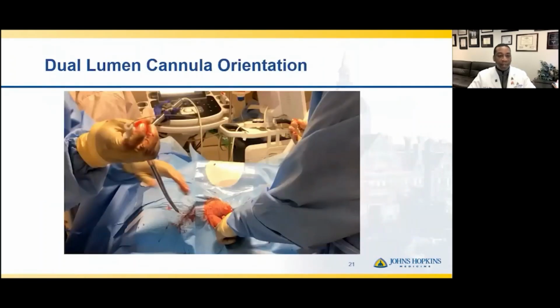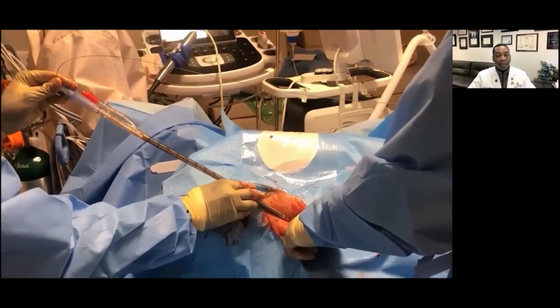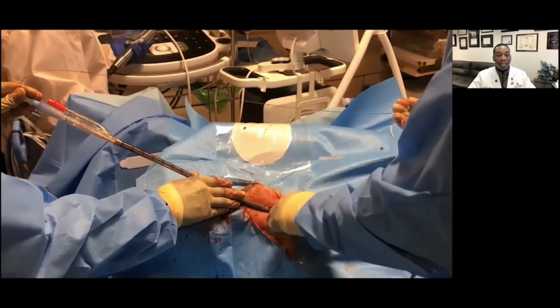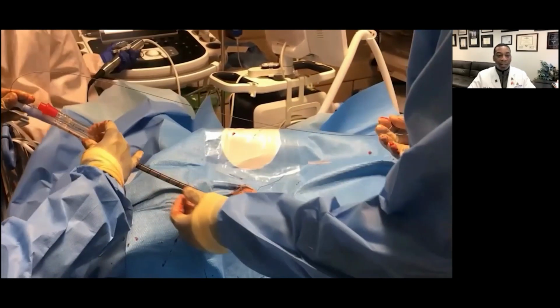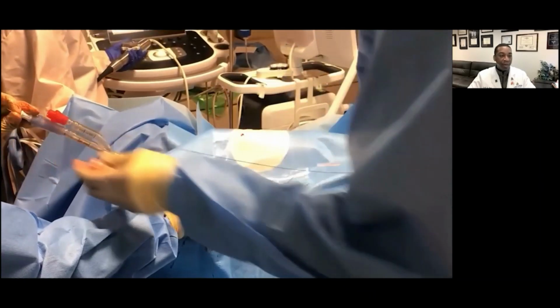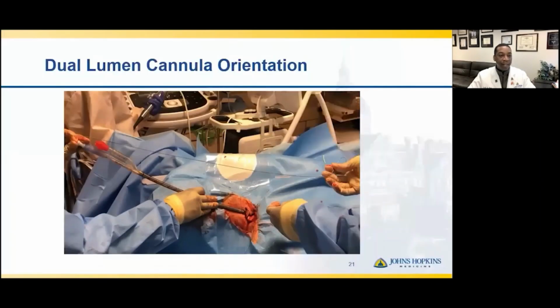In this video, again, we'll show how the cannula is oriented. Now, even though this venotomy has been dilated to 32 French, if you notice, you can engage the cannula without actually inserting it, and it will occlude the vein so that there's no hemorrhage. Therefore, in a controlled manner, you can orient the cannula correctly, anteriorly and slightly towards the left, in the position that would be expected.